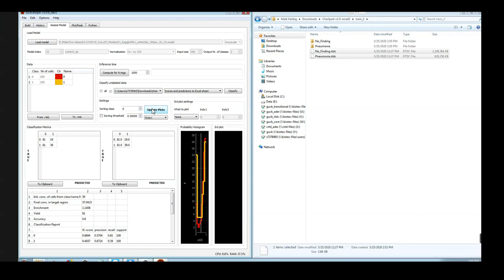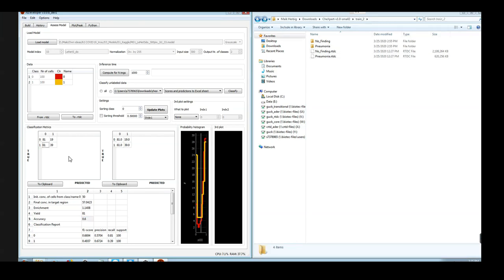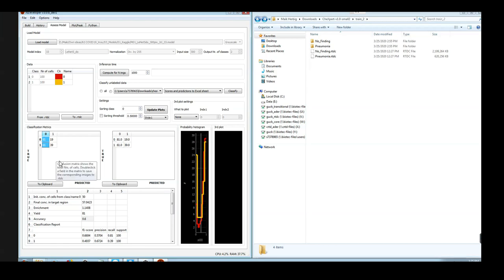Now I can see that the accuracy on this other dataset did drop down to 0.6, which is a bit disappointing. When having a look at the confusion matrix, we can see that the model has a clear preference to predict the label 0, which means 'no finding.' In conclusion, one can say that using this dataset from Kaggle and this particular model will not result in a model that is robust enough to be applied on another dataset. Therefore I would now like to try the other way around by first training on the Chexpert dataset. This dataset is larger, and I therefore hope to obtain a more robust model.